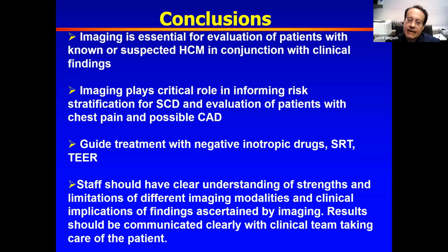And in most patients, CMR is of value as well, particularly if you're looking at suboptimal echocardiographic images, if you're looking at borderline cases in making the call of hypertrophy or not, if you're suspicious of an apical aneurysm, if somebody has some borderline risk factors and you want to tip the balance one way or the other and you're looking for late gadolinium enhancement.